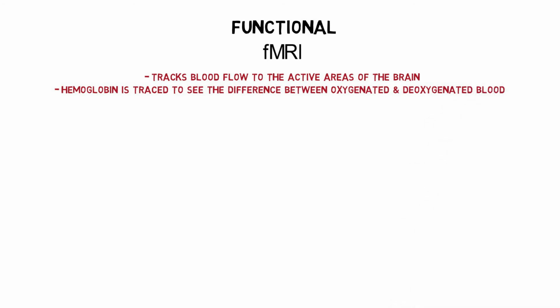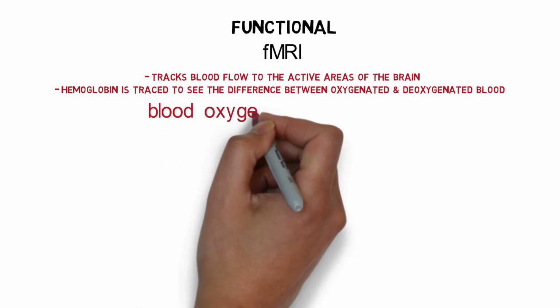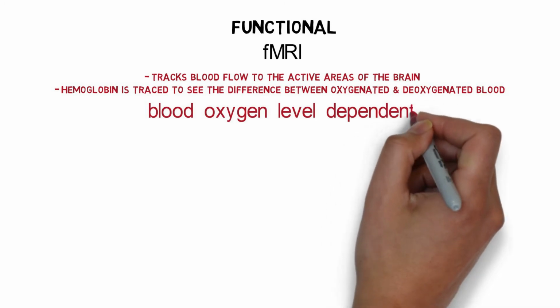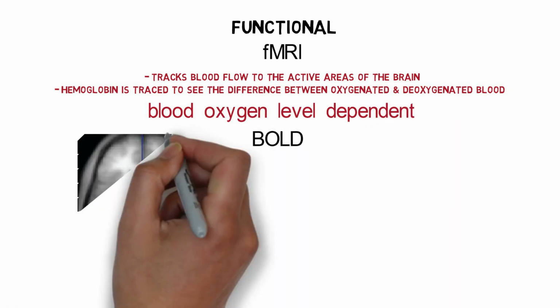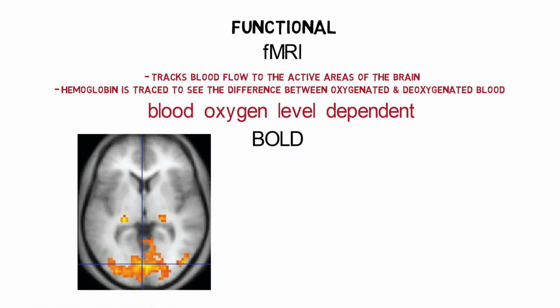When we use different areas of our brains, oxygenated blood is recruited, resulting in an activation of the blood oxygen level dependent, or BOLD, response. fMRI is more vague than a normal MRI, but by using them in conjunction and overlaying the BOLD results on the structural MRI, brain function can be mapped for different activities. This can show functional areas of the brain.